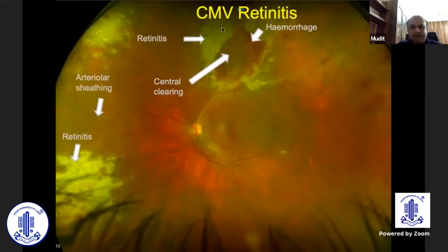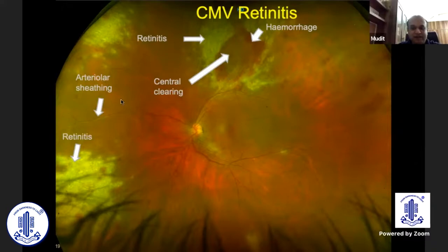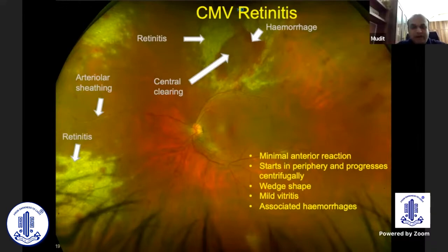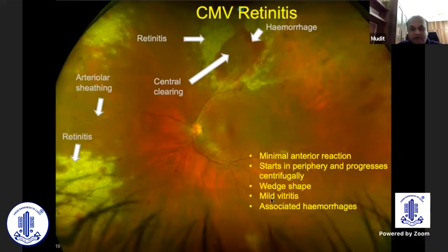Another common pattern to recognize is CMV retinitis. You may see areas of retinitis with associated hemorrhages, some areas of central clearing, arterial sheathing, and patches of retinitis — when you see this pattern, think CMV retinitis. In many of these cases you may not see significant anterior chamber or vitreous reaction because the patient may be immunocompromised and unable to launch an immune response. These lesions often start in the periphery and progress centrifugally, forming a wedge-shaped lesion, with mild or absent vitritis and associated hemorrhages.